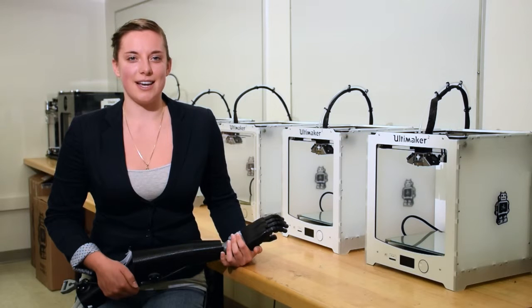At the end of the day, a good design is only the beginning. The Victoria Hand Project isn't just about creating a 3D printed prosthesis — it's about creating a prosthesis system that's affordable and accessible to amputees in developing countries.